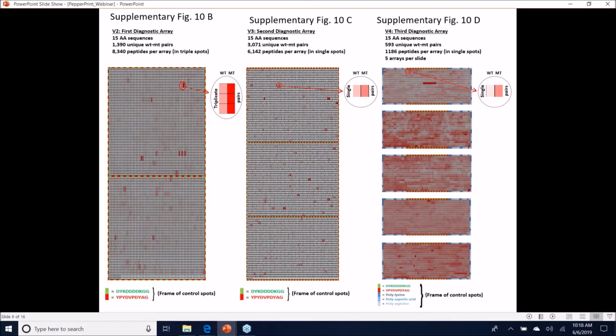So is that all that's happening? Granted, we were just checking only 348 genes. There are 25,000 genes that are available in the human genome. So one idea is to increase that. Second idea was, well, can we test for presence of mutation signatures against other breast cancer mutated genes? So there are 2 studies that we relied on, where they've looked at mutations, one from 15 breast cancer and another one from 70 breast cancer.